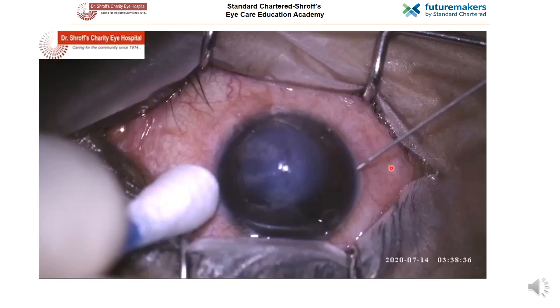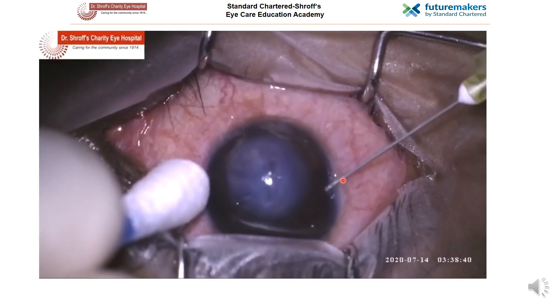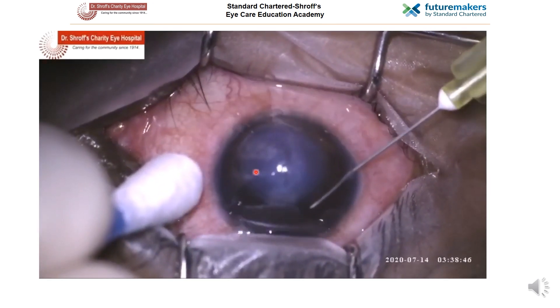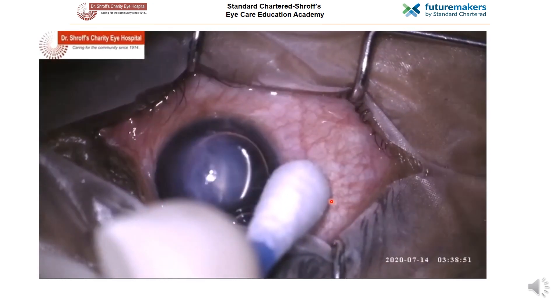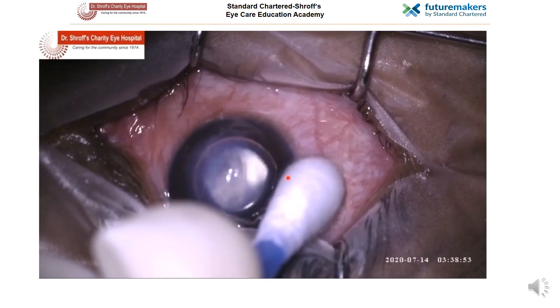This is a surgical video demonstrating the procedure of air or C3F8 Desmatopexy in a patient of acute corneal hydrops. Any site in the peripheral clear cornea can be used for entry. A 30-gauge needle is taken and directed towards the angle — not towards the pupil — and kept over the iris at all times, taking care not to touch the lens. Air or gas is then injected, and a bud is kept on the site of opening before the needle is withdrawn to prevent air from escaping. The bud should be removed after a period of 1 minute.